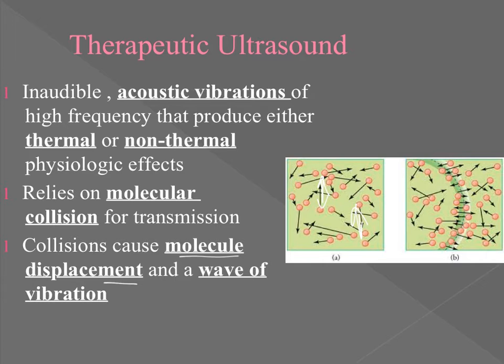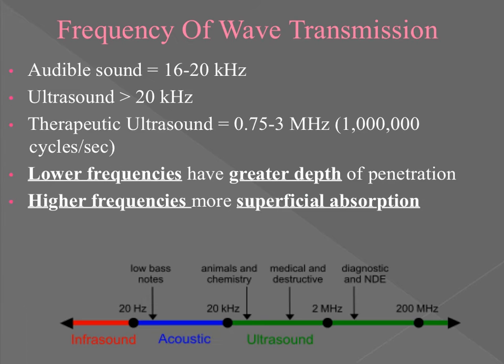So you can read the slide, but I think I've broken it down in such a way that it actually makes sense to us as clinicians. As we progress through this lecture, it becomes important to continue to think about the modalities on a frequency spectrum, right? We looked at cryotherapy and thermotherapy and we saw where it fell on the frequency spectrum. And now we're looking at therapeutic ultrasound and also asking ourselves, where does it sit on the frequency spectrum when compared to the normal things that we do within our daily lives, right?